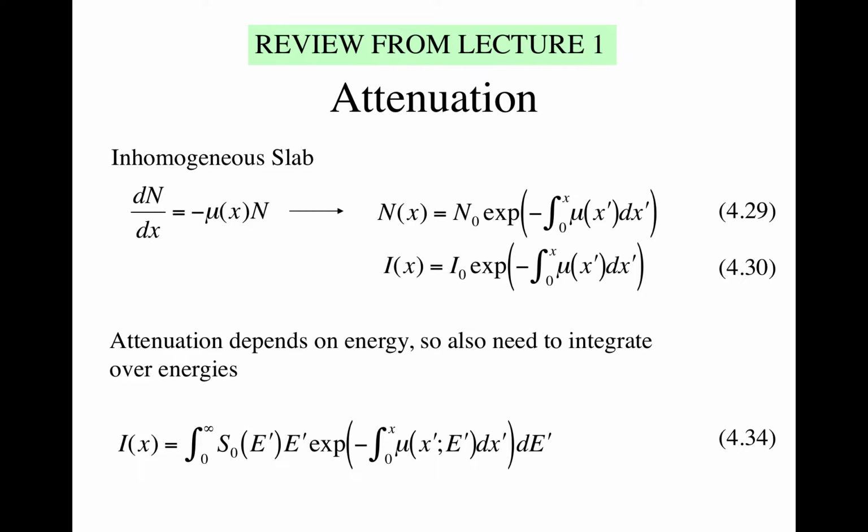And then, to be absolutely accurate, we also have to acknowledge the fact that the mu value, or the amount of attenuation, is energy dependent. And so high energy X-rays will not be attenuated as quickly as lower energy X-rays. And that's, if we go back to that first lecture, there's a graph and it shows you the mu values as a function of energy.